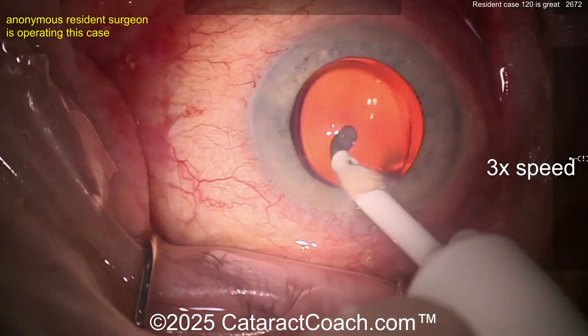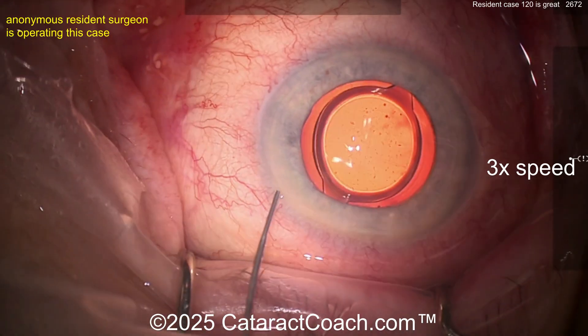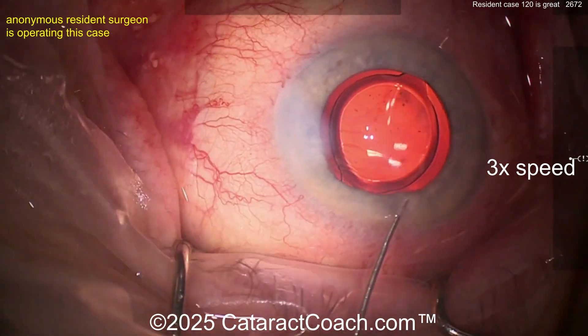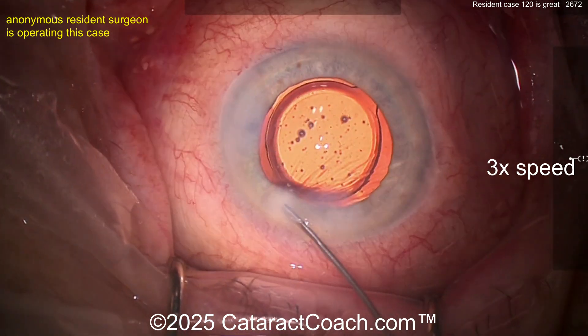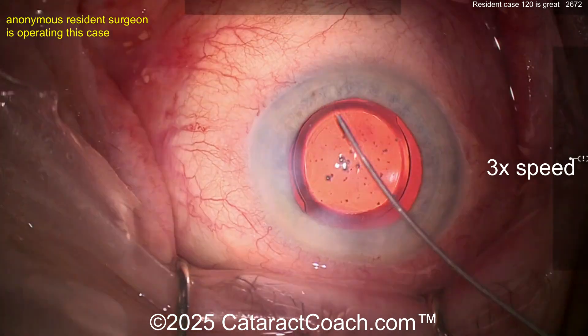Get that opened up nice and easy — just opening it up and positioning it with the phaco probe. Save a step. Look at the rhexis now — the rhexis overlaps the optic very nicely, 360 degrees. That is fantastic. At case 120, you need to learn how to go behind the optic a little bit. That's a little too much hydration for me — that's going to induce astigmatism.